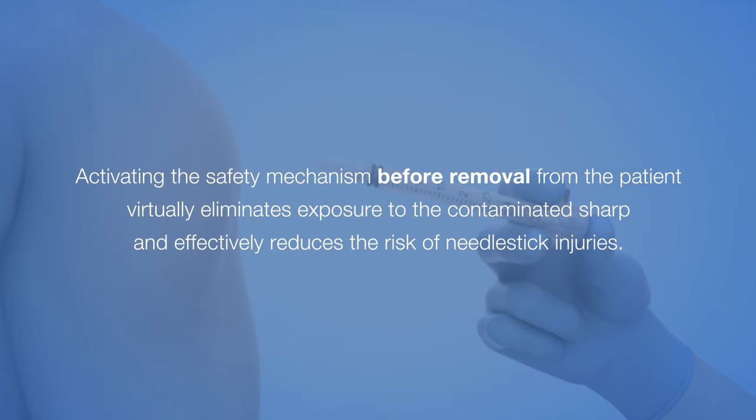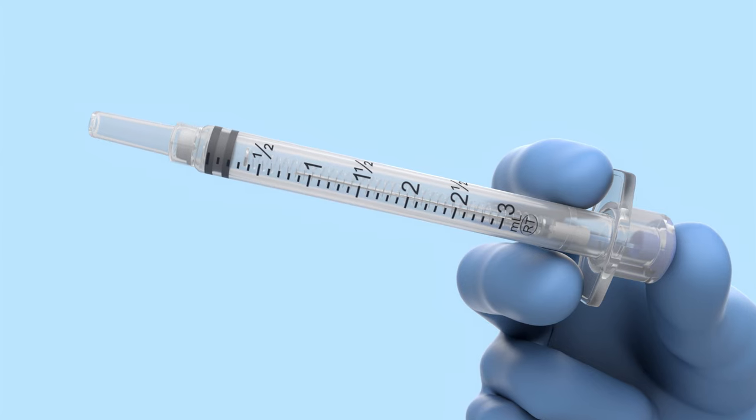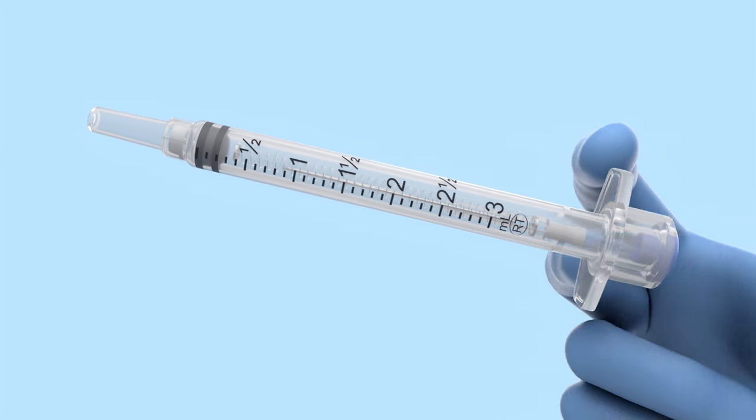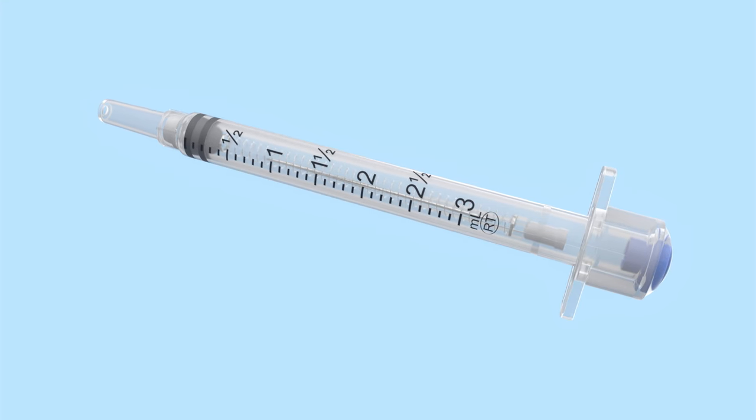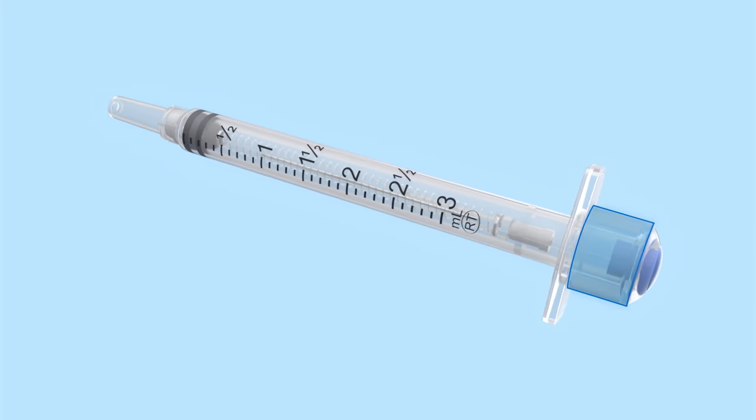Activating the safety mechanism before removal from the patient virtually eliminates exposure to the contaminated sharp and effectively reduces the risk of needle stick injuries. When fully depressed, the end of the plunger handle of 3 mL and larger Vanish Point Syringes should be flush with the collar behind the flanges.